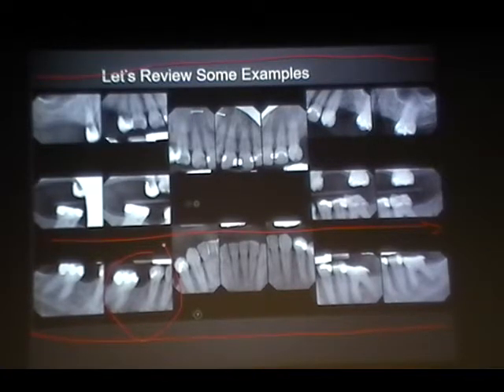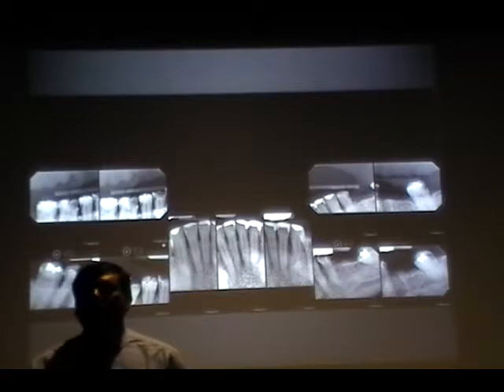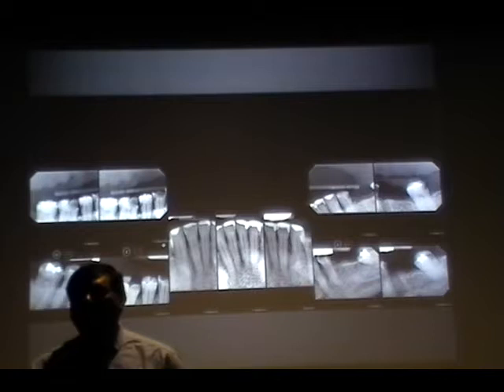We'll review one more example, and then we'll take a 1 minute break. Back with the other example, when the molars are missing, do you still want to start it more posteriorly? Because in that last picture it still showed part of the premolar. Do you want to start it where that first molar starts, with just space, or just focus right on the first molar? Should you just center it on the tooth, or should you show the open spaces? Just follow the protocol for molar view. You have to place the bite block on the second molar.